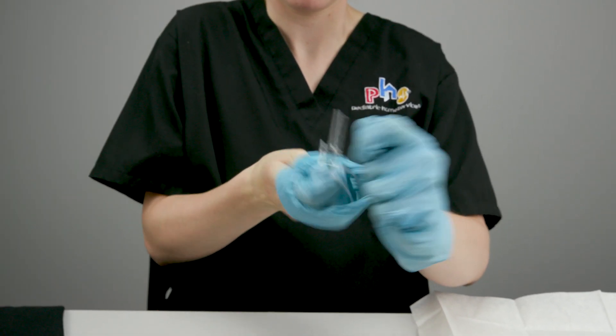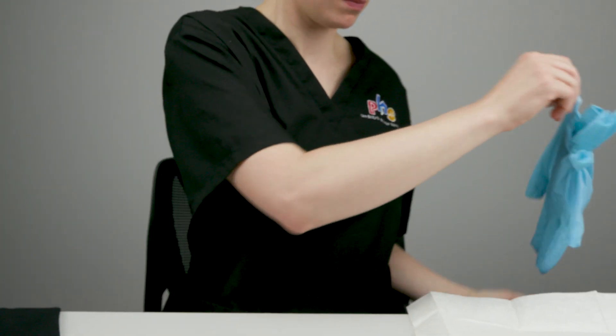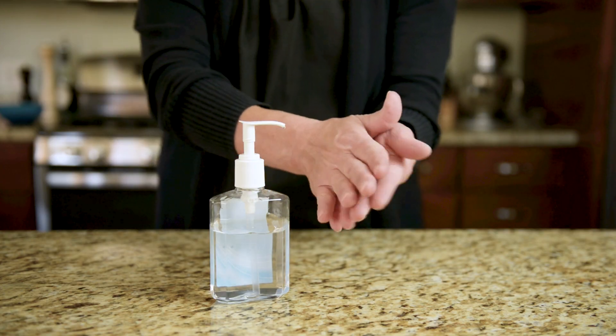Remove your gloves and clean your hands.